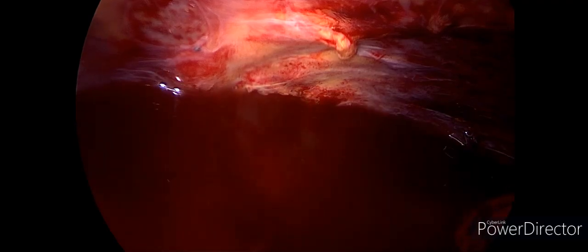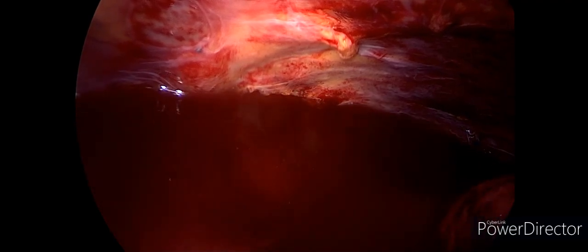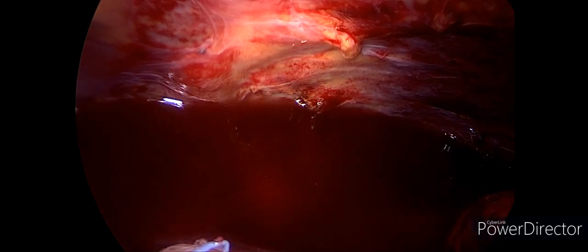The posterior segment of the upper lobe will be expanded soon, and all the fluid is suctioned out.